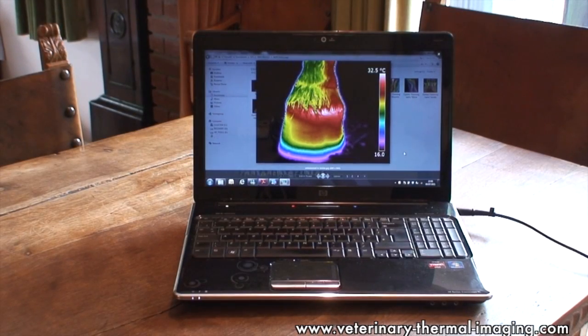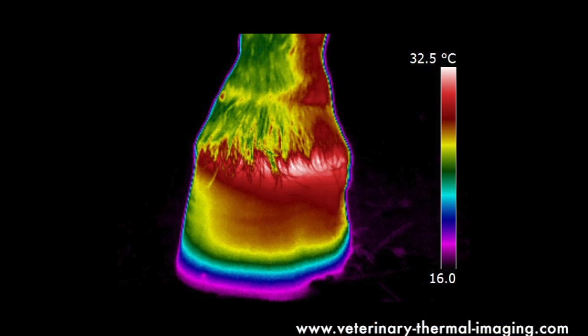This thermal image shows just how important correct hoof balance is. You can see a real widening of the thermal band towards the inside of this hoof, and you can also see the associated strain being placed on the supporting structures — the collateral ligaments — down the inside of the leg as well, up to the fetlock. So this horse is unbalanced to the inside. Where the horse is imbalanced and the hoof is in effect a bit too short, more pressure is being put through the leg on that side, and that pressure creates extra friction and heat, which the thermal imaging camera can pick up.